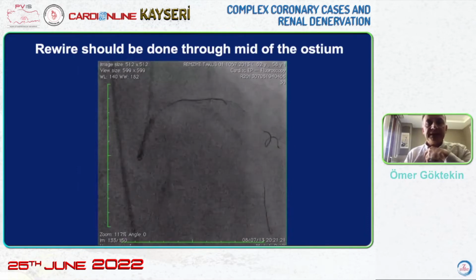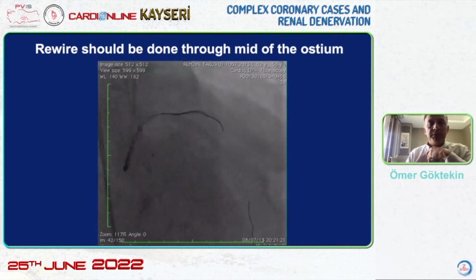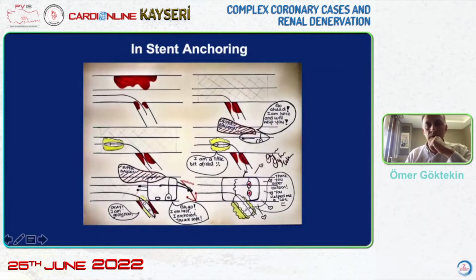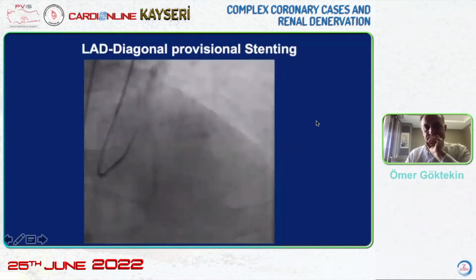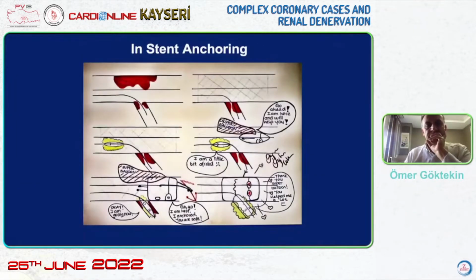The wire is left there. There's a second wire. Put it in the midway. The second wire is below the first wire. Another important event and advantage is the anchoring advantage.